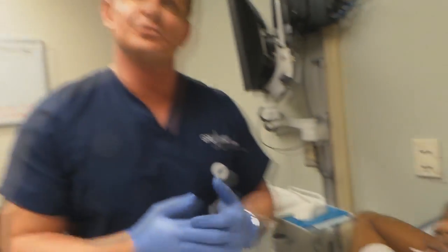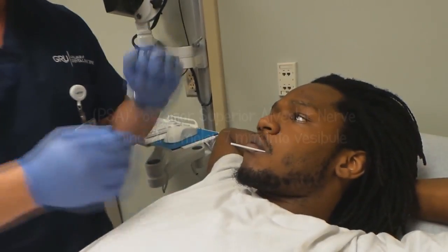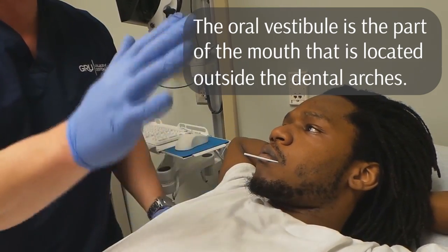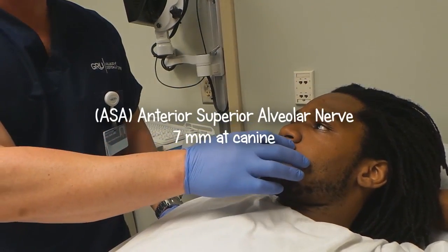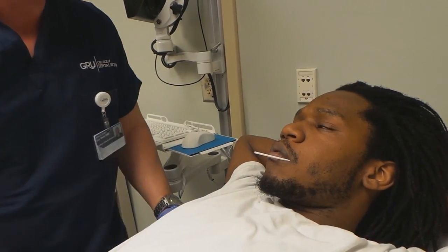For the PSA, you want to get behind the second molar, then take the needle and infiltrate the vestibule about seven millimeters up in there, and then place the injection — that will block the nerve. Then you have the MSA — same thing, vestibule, seven millimeters. Anterior is above the canine, apex of the canine, about seven millimeters you want to inject in there.